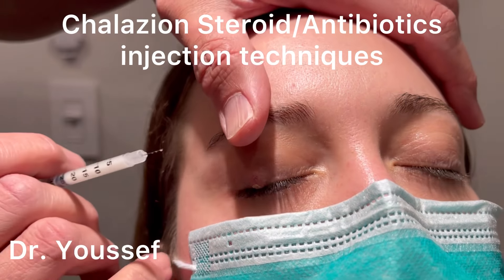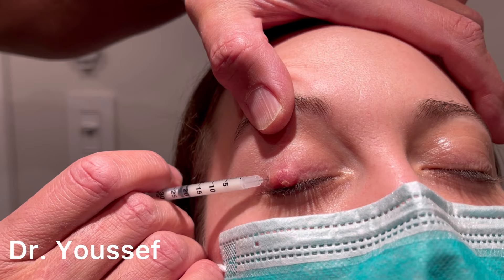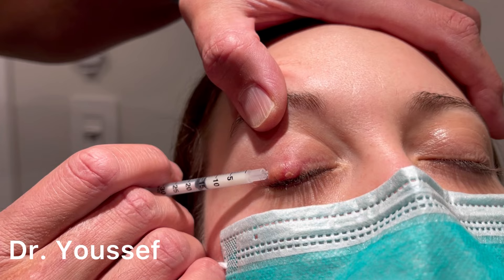This is how I do the injection of steroids, antibiotic, and xylokane into the chalazion. Part of it is injected outside the eye and under the muscle, so it's not visible through the skin. And then some of it inside the chalazion itself, which is a little bit more painful but is more effective.